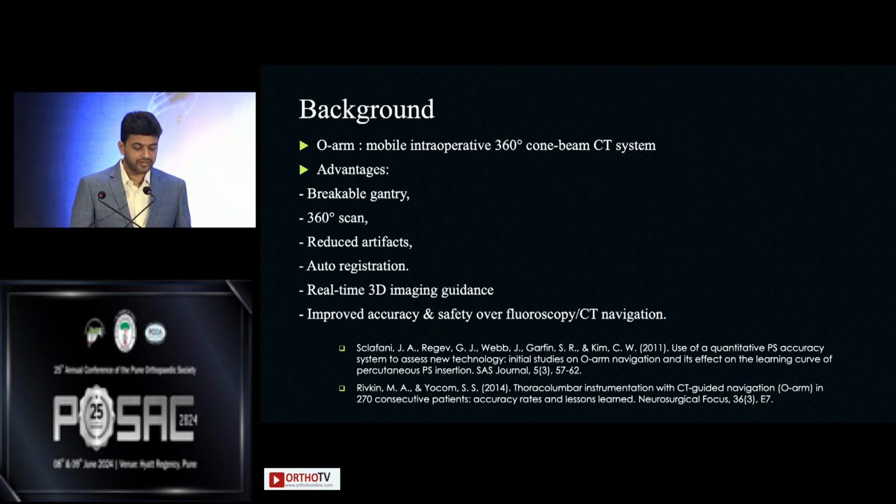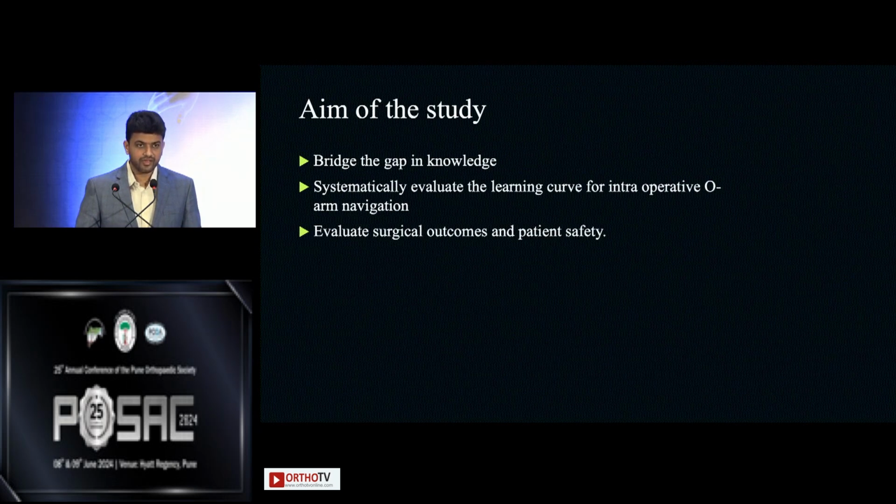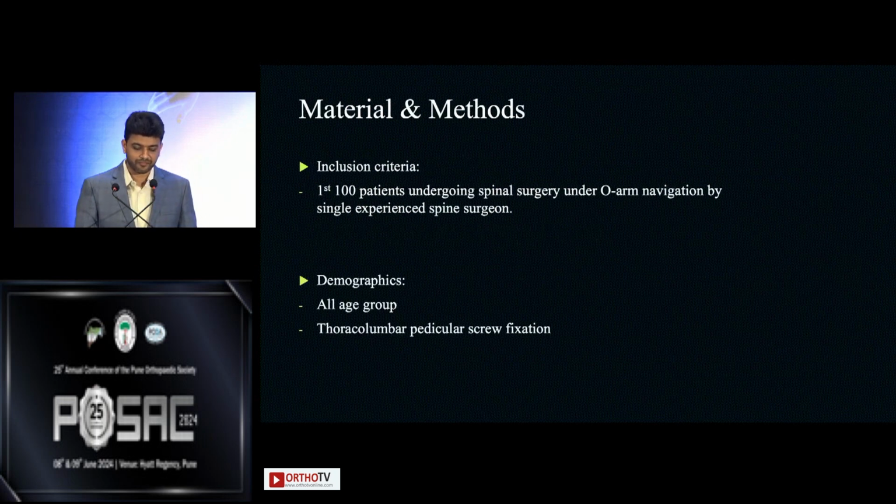It has reduced artifacts. It allows quick registration without wasting any time. There are real-time 3D images showing sagittal, axial, as well as coronal views of the vertebra. Then it has improved accuracy and safety over fluoroscopy and CT navigation. The aim of the study is to bridge the knowledge gap on the learning curve for the surgeons, systematically evaluate the learning curve, and evaluate the outcomes and the patient safety for the O-arm.